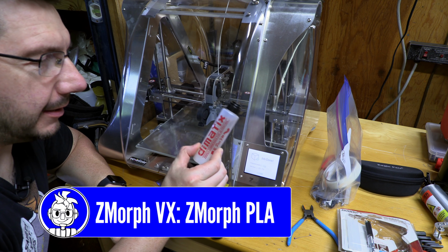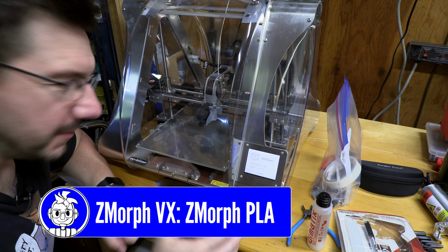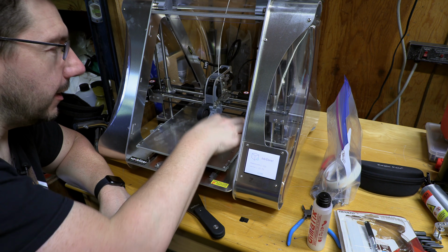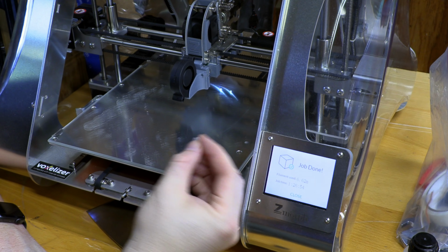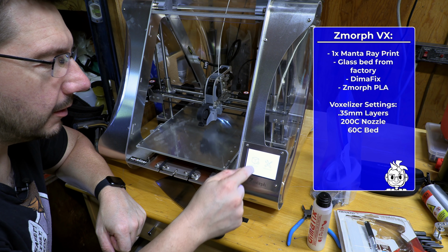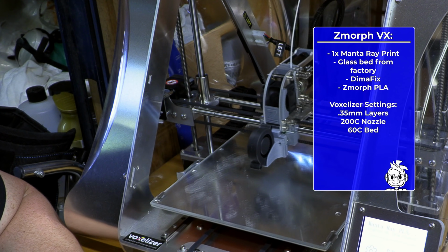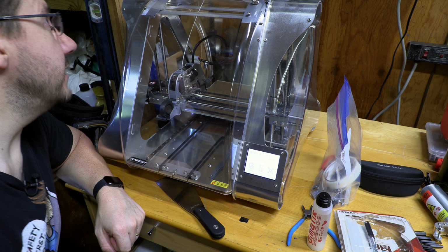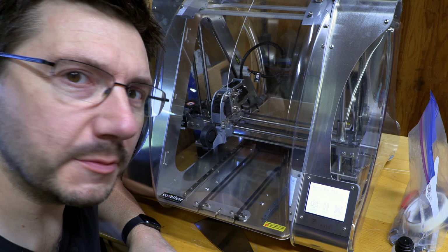Hey, this is the Zmorph VX. It's got a glass build plate, and they sent me this DimaFix to use on it. It works pretty well. Again, jobs are set up, and so what I have to do is open that up and clear this. This is the little, instead of a skirt, just a little dot worth of filament to kind of prime the nozzle. I hit close, new job. The file's already set up, so I hit play, and that's it. And I close that, and it goes to work. It's running with Zmorph filament that they sent. It's just PLA. Next machine.